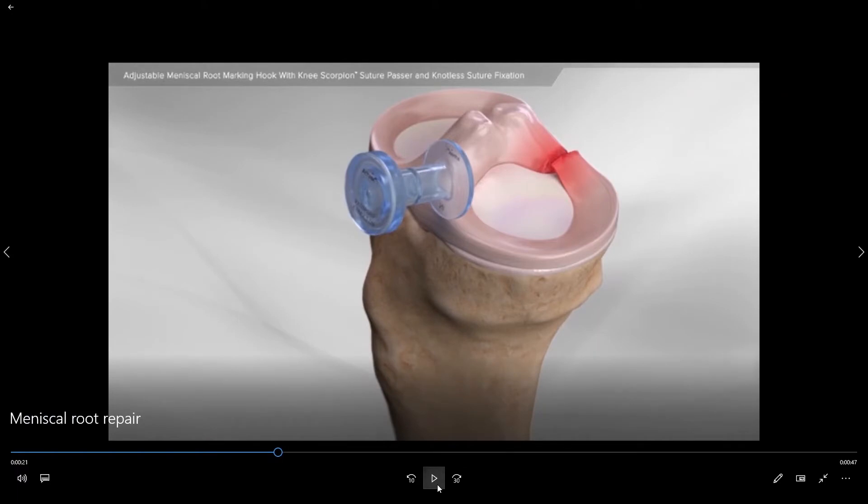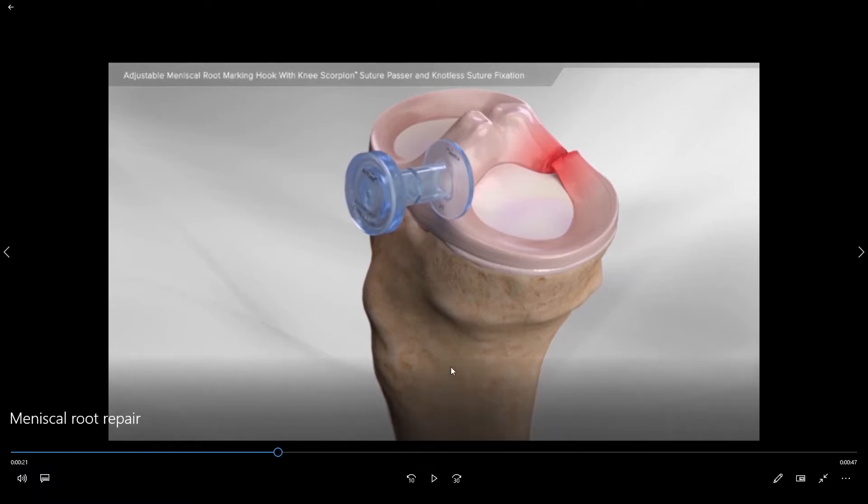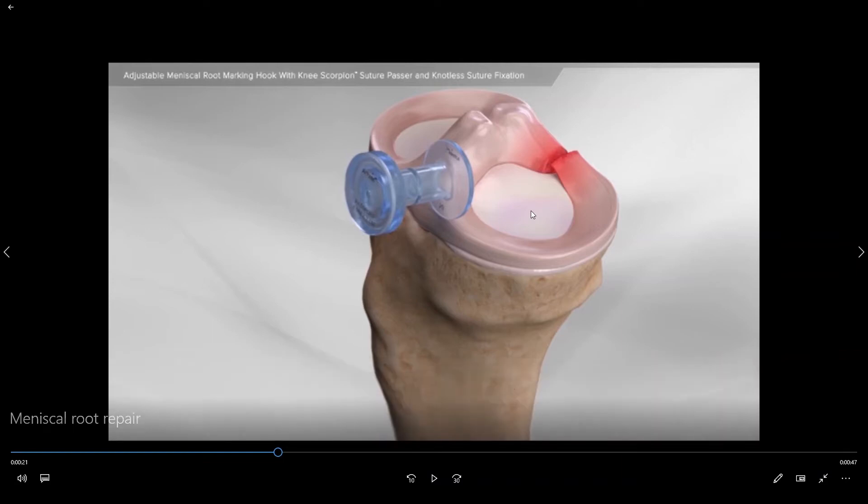In this animation we have now removed the upper femur and we are looking at a posterior root tear of the posterior horn of the medial meniscus. The meniscus is a c-shaped cartilage that goes around the outer portion of the joint on both sides. The outside meniscus is called the lateral meniscus, the inside is called the medial meniscus, and as you can see it deepens the socket and gives extra cushioning or shock absorption when you are playing sports or working.